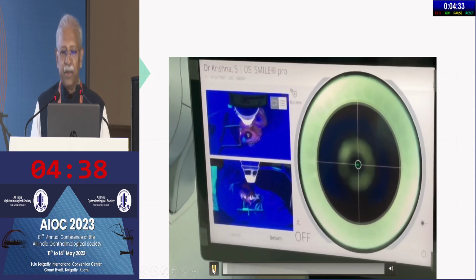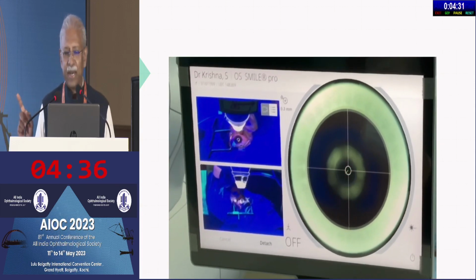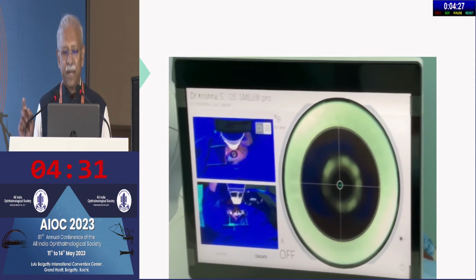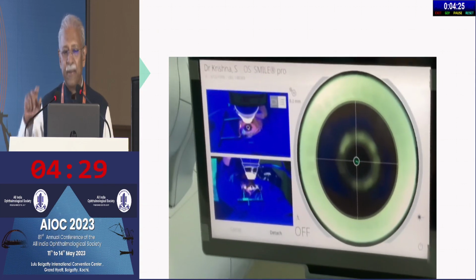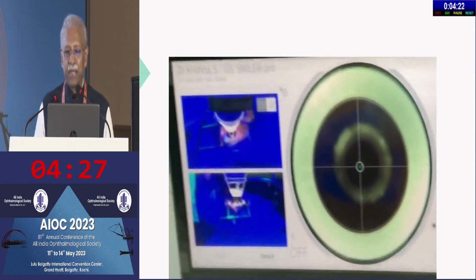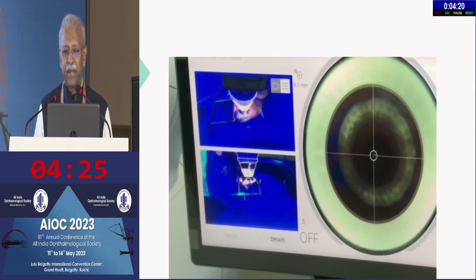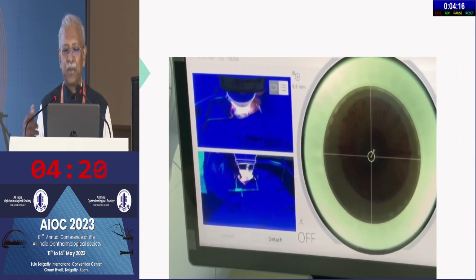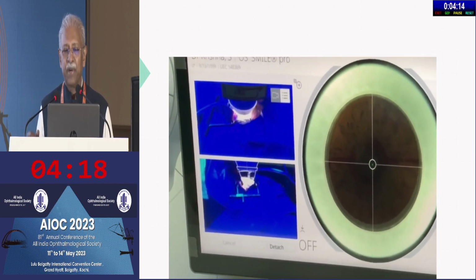You see that line. You shorten that line and get the green dot onto the yellow dot. Then you're perfectly centered. Number two, you notice that the pupil center is marked out by the machine. That gives you another added advantage. The pupil center also is seen very clearly on the microscope. So all this put together gives you absolutely perfect centration.